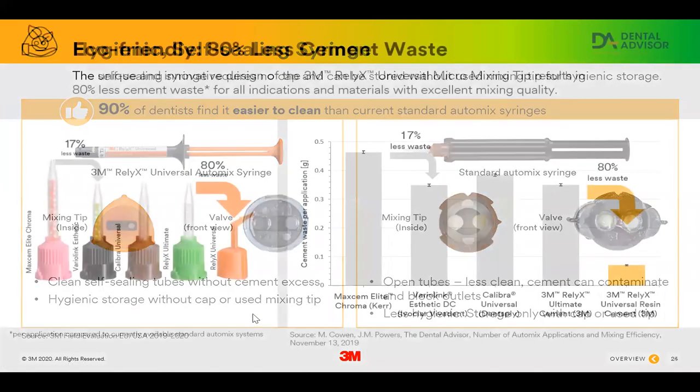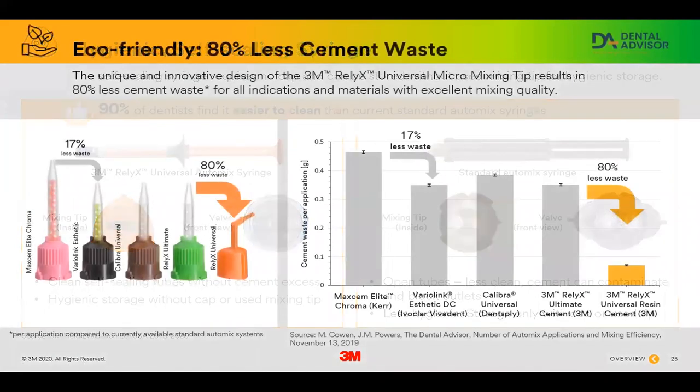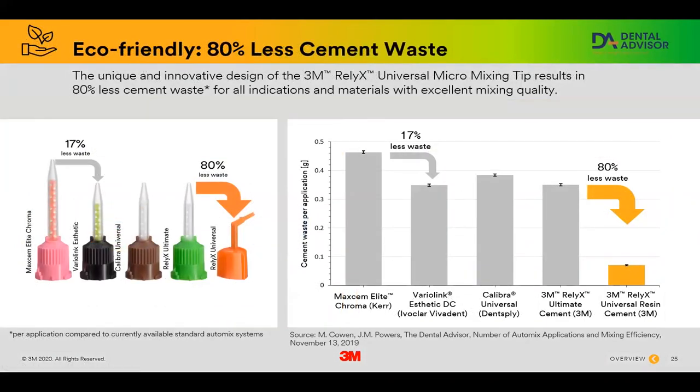Here is this information from the Dental Advisor. This is third party data, just comparing different mix tips. And like I said, I bet you've all seen all of these. The product that it's intended for use with is next to it. And really, one of these is not supposed to be used for each one. Although they look very similar, inside they have different numbers of paddles. So if you don't use the right mix tip, you're really going to compromise the mix of the two parts of the cement. And you can just see here how much smaller this new mix tip is.